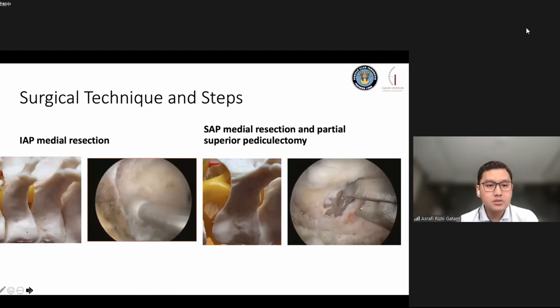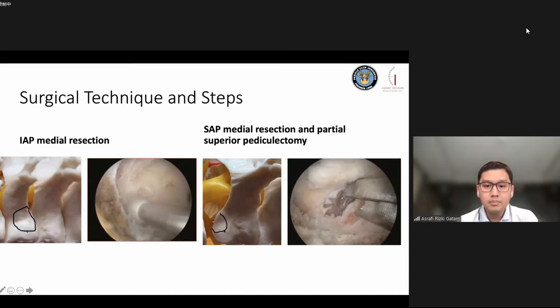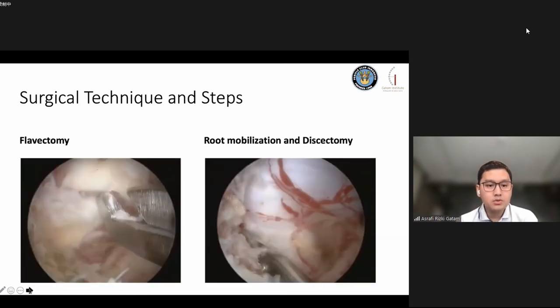The next step is IAP medial resection: removing the medial IAP, then removing part of the SAP until we can see the ligamentum flavum. At the lower part, this is the natural detachment point for the ligamentum flavum. After that, laminectomy is performed, then root mobilization and discectomy.